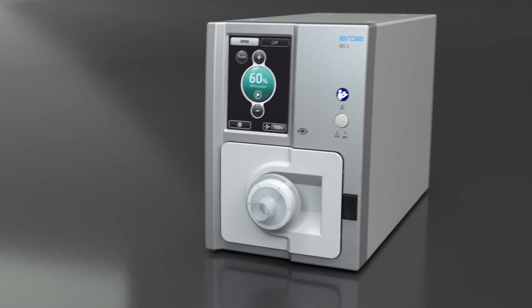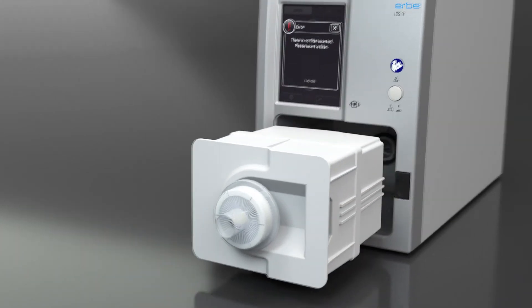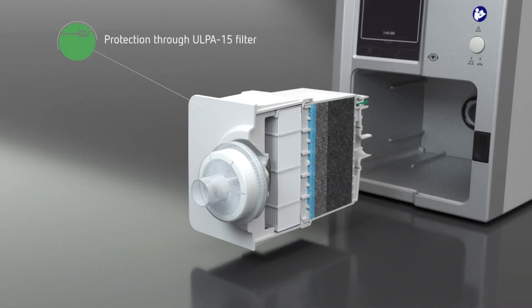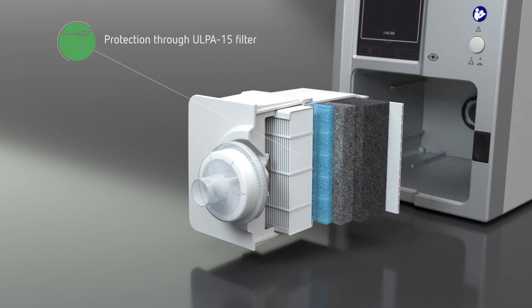The five-stage high-efficiency filter removes virtually all particles with diameters of 0.1 micrometers and more. Thus, this filter offers the best possible degree of safety.